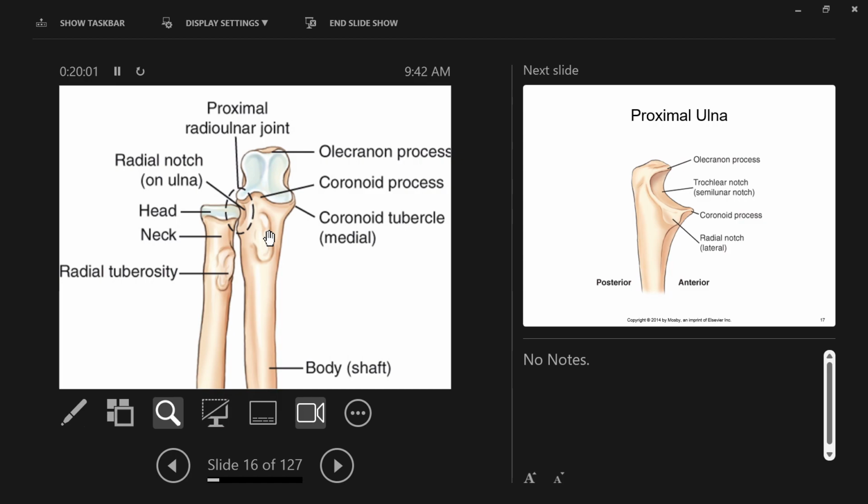So was she able to do the images with the patient partially flexed, right? She kind of got her to let go of the pillow and kept it like this. Gotcha. She has to do things differently, right? And you've done other elbows besides that, right? And it's different, right?